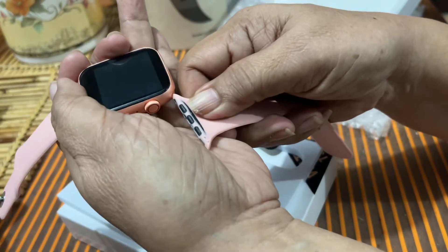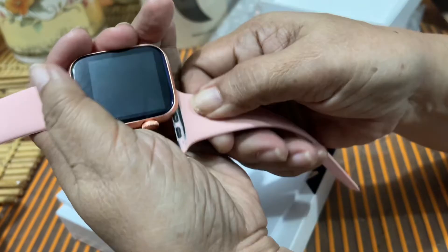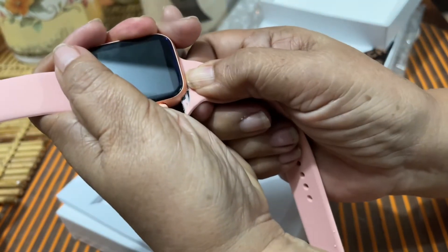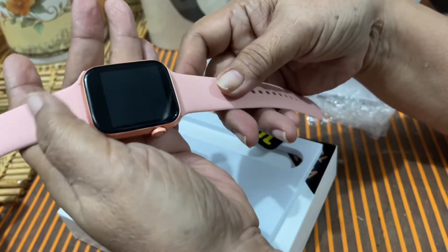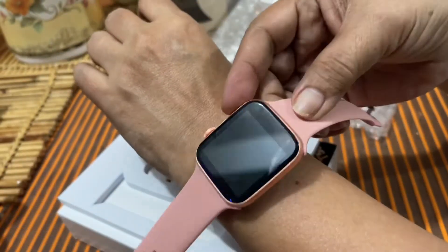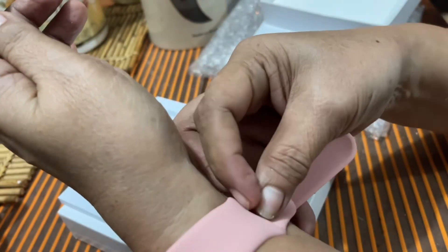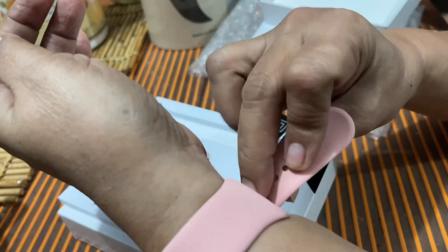Siyempre, alam naman ang mga medyo senior — kailangan subok-subok, lalo na kung COVID ngayon, di mo naman pwedeng pagawa sa iba — try mo na lang sa sarili mo. Kasi yung doktor naming mag-asawa palaging sinasabi, mag-record kami ng aming blood pressure. Pareho kasi kami may high blood pressure, pareho kaming diabetic.